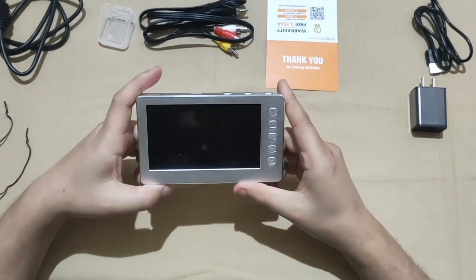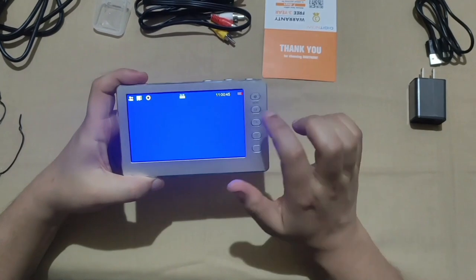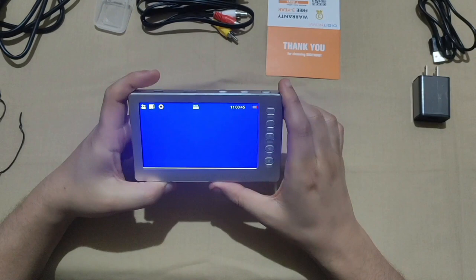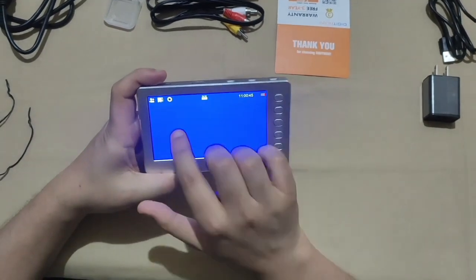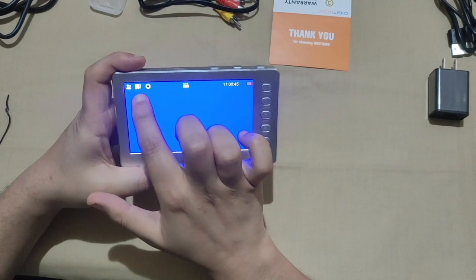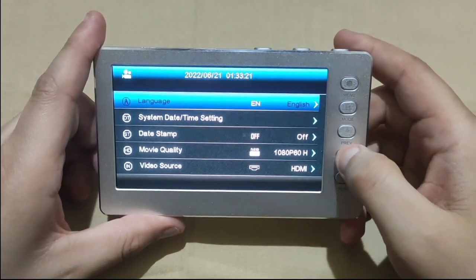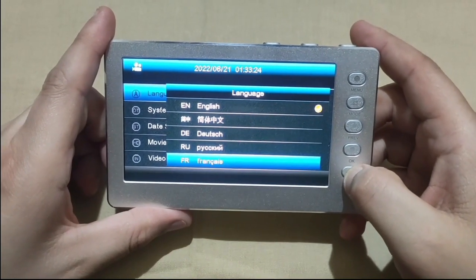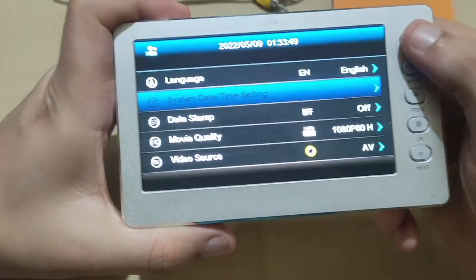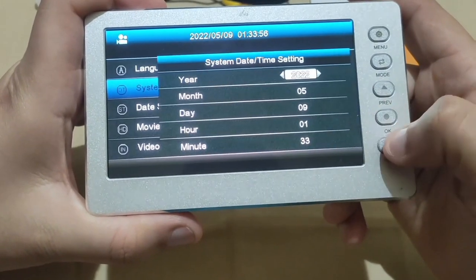Now, let's review the software of the device. This is the estimated recording time on the inserted 64GB SD card from the AV source. These icons refer to AV source, video recording mode, and the default storage device. To change the language, press the menu button. Go to language and choose your preferred language. To change the time and date, go to System Date and Time Setting and set the time and date by using the right and left buttons on the top of the device.